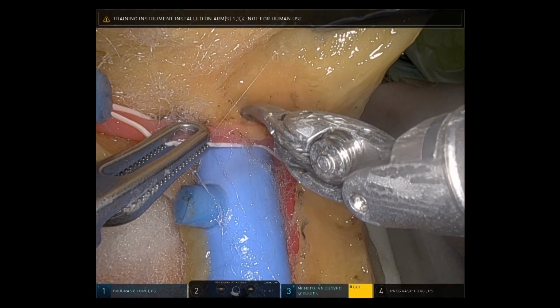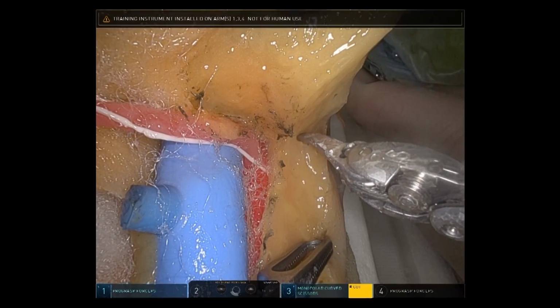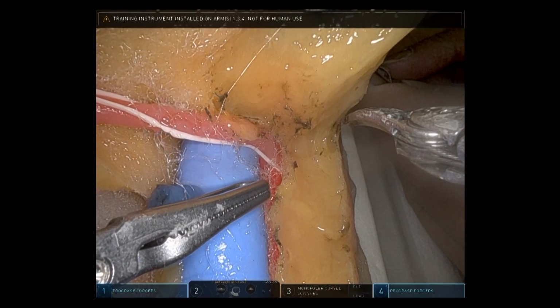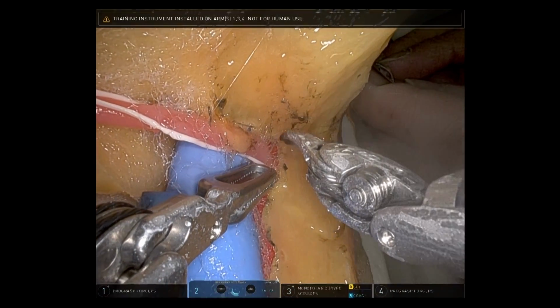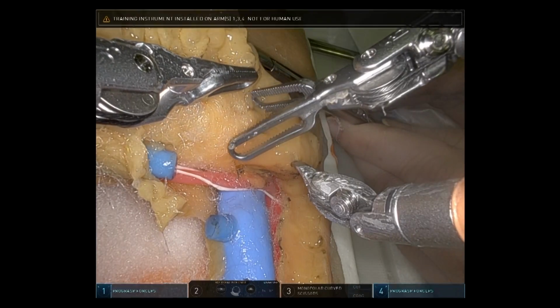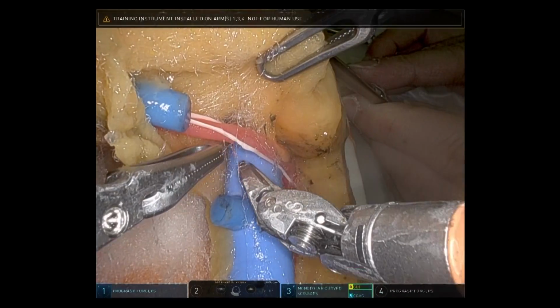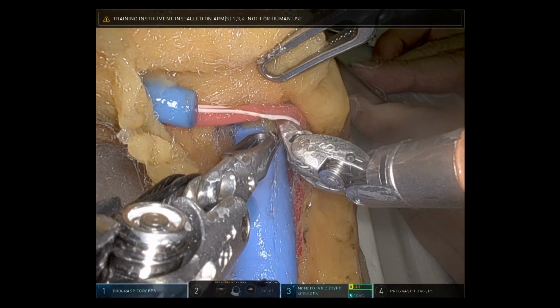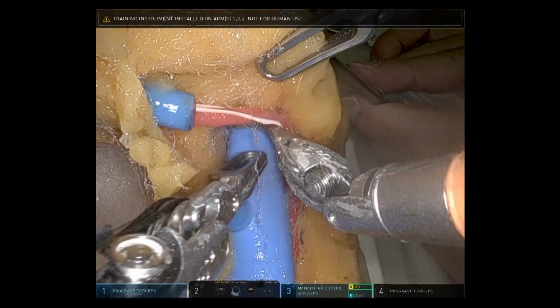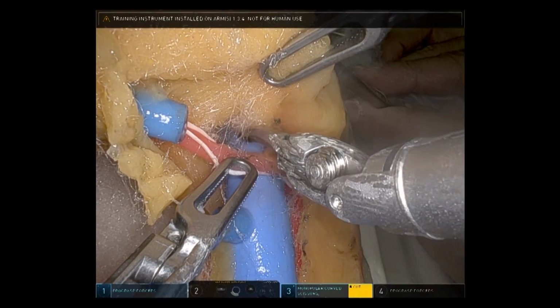Dissection is carried out in the region corresponding to lymph node station 203, keeping the anatomical boundaries in mind. The space between the ileocolic artery and SMV is dissected, the ileocolic artery is encircled, and the artery is divided at its origin.